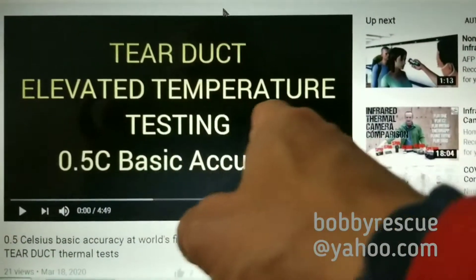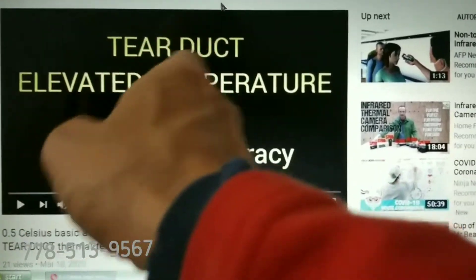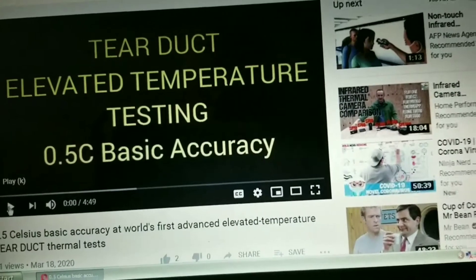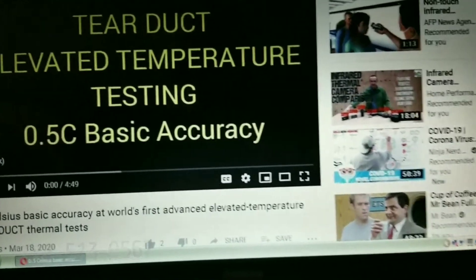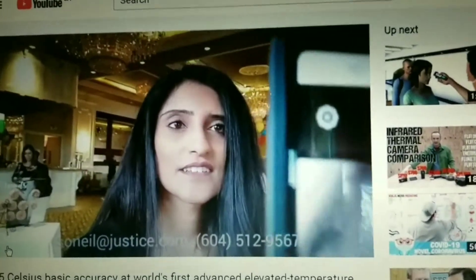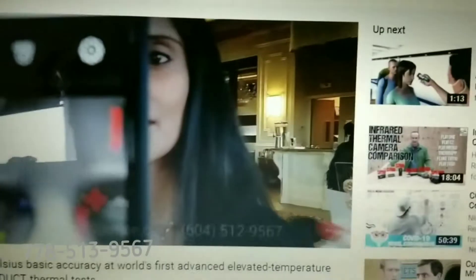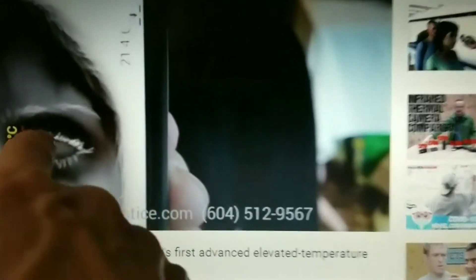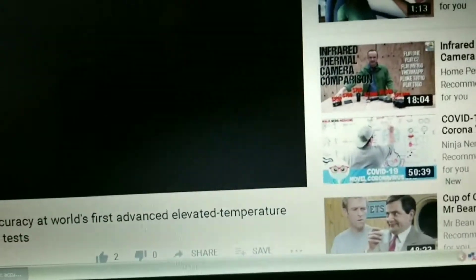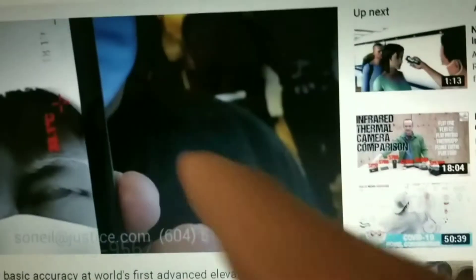We've discovered that tear duct temperature testing — we have a device that does elevated tear duct temperature testing. You can watch this on YouTube. We found that different people have different temperatures. First, you have to take their glasses off or it doesn't read correctly. Second, some people just have a naturally lower temperature than what you'll find in systems that average the face. We have pinpoint accuracy — actually pinpointing on a pixel basis. This fellow here has an abnormally low temperature.